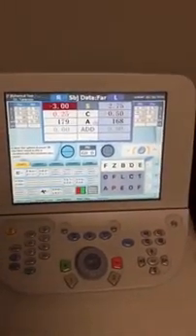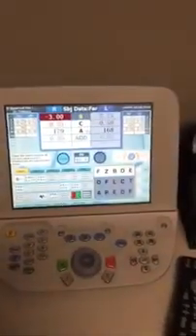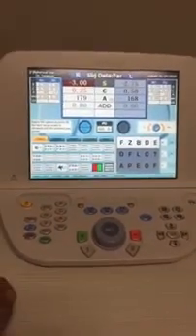It always starts on a 20/40 line. So if you look up at the M&S system right here, that's the 20/40 line. If the patient can't read that 20/40 line, you can start with a higher letter by using the plus button here on the M&S remote, and you can see I went up to the 20/50 line, 20/60 line, depending on where the patient can see. But most of the time, patients can see that 20/40 line. So I just want to go over what I would do in a refraction in this case, and kind of review so that you have an idea of what you need to do in the process.